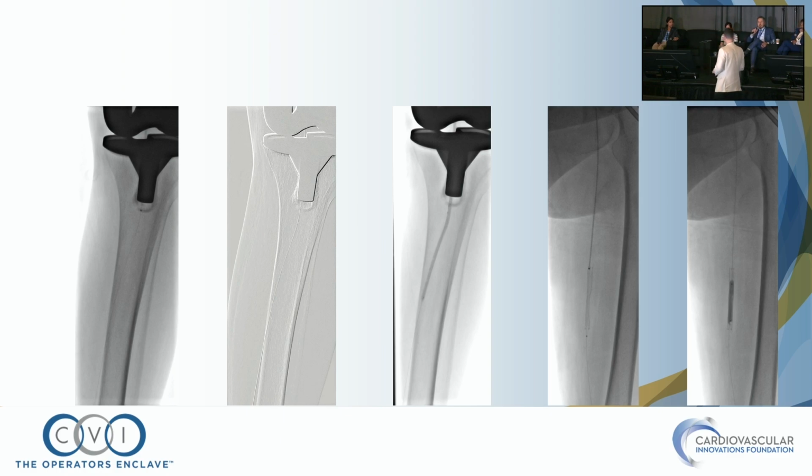Having the SFA probably open, you really didn't achieve anything. So I think what you're doing is absolutely correct. I mean, you're trying to get some blood flow. Otherwise, all the work you've done is just not enough. Great points, Zach. Thank you. Actually, when I do these cases, I feel like less is more sometimes. So definitely, with acute limb, you just need to establish flow.